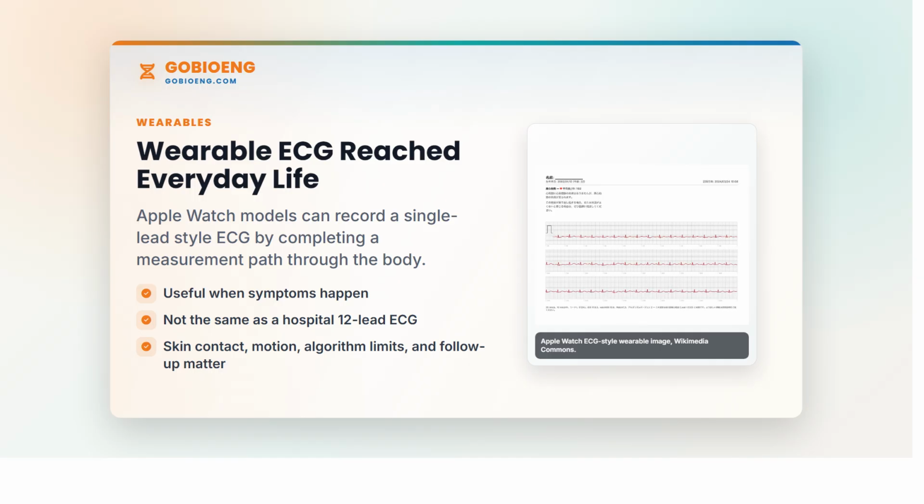Digital ECG data is now also used with automated interpretation and machine learning. Algorithms can help with rhythm detection, interval measurement, and pattern recognition. Some research systems look for subtle ECG features that may predict future conditions. Students should be excited, but cautious.